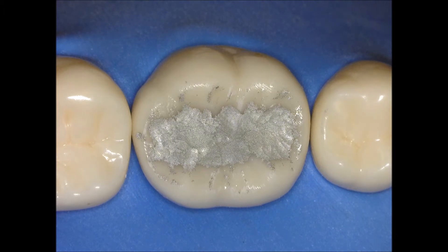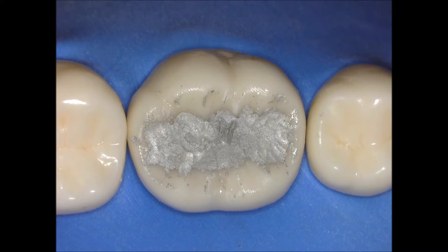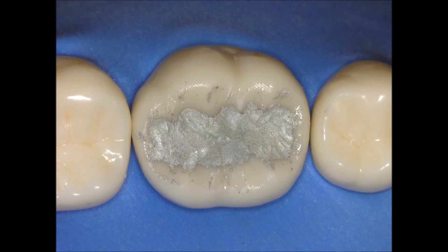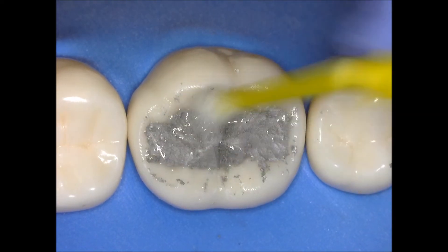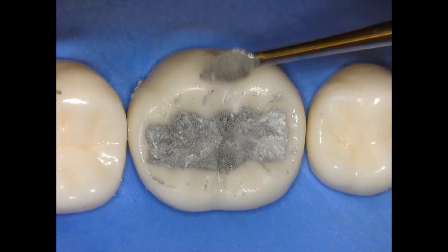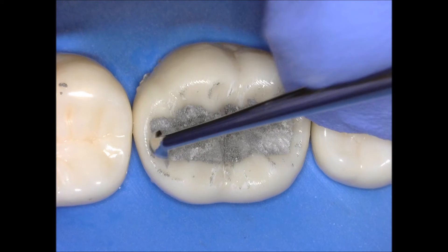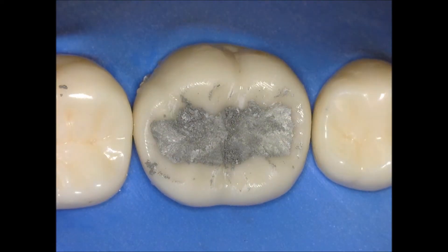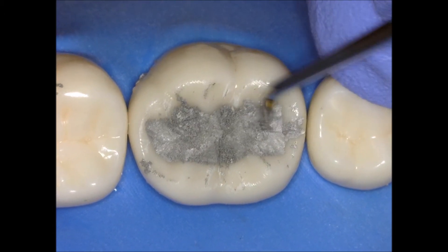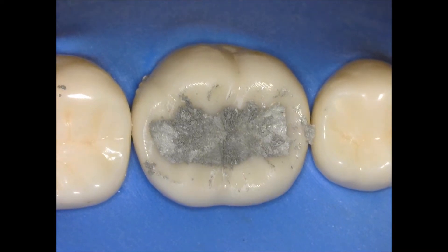I go over that with the Hollenbeck because it's a good instrument to create that first anatomy. After creating this first anatomy and removing some of the excess in the grooves, I'm going to switch to another instrument. I'll put a little bit of water in there just to remove some of the excess, clean up, and see better what you have. Now I'm using my cleoidiscoid — the clioid, the pointy part — used to create the fossa and the pit. This is a triangular fossa, which is why I'm using the clioid. I create the mesial and distal fossa with the pointy part, and then switch to the round part to smooth it out. In dentistry we don't want anything sharp — everything should be smooth and round.